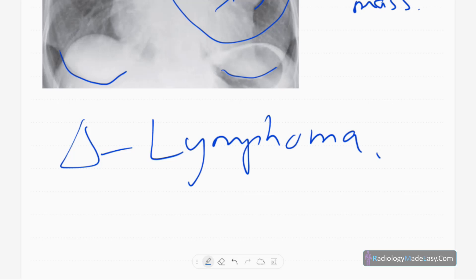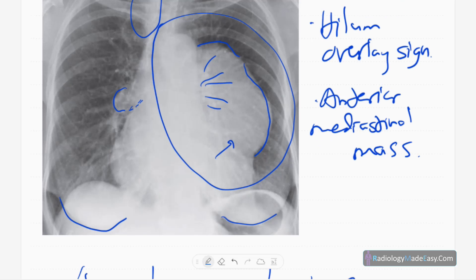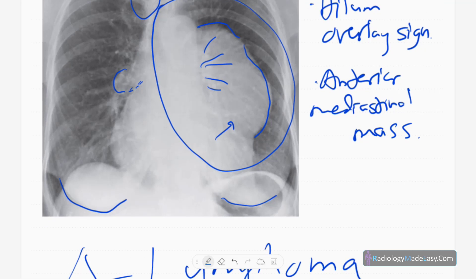In this case, the diagnosis is lymphoma, because the lymph node masses have a lobulated outline — you can see that lobulated outline here. There is also lymphadenopathy in the right hilar region, adding further support to this diagnosis.